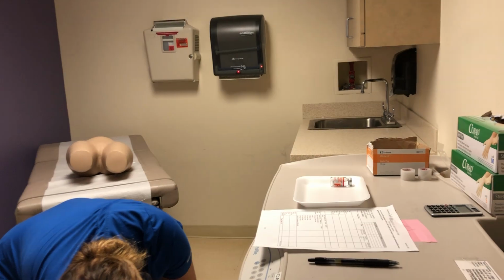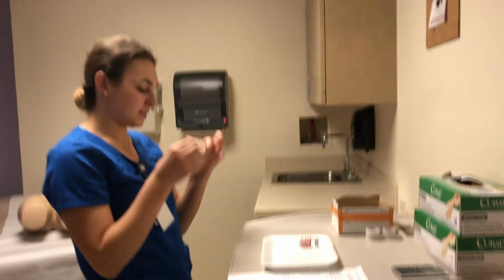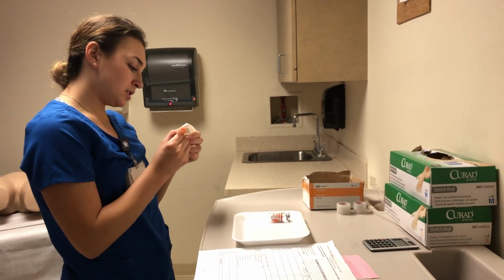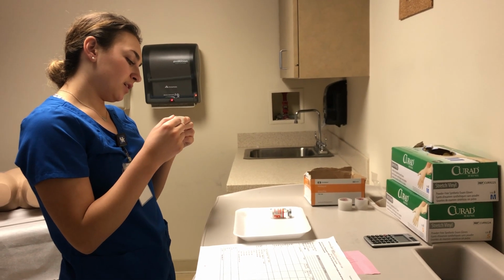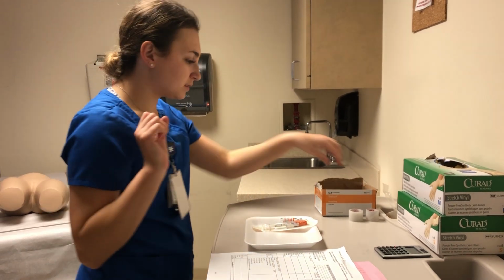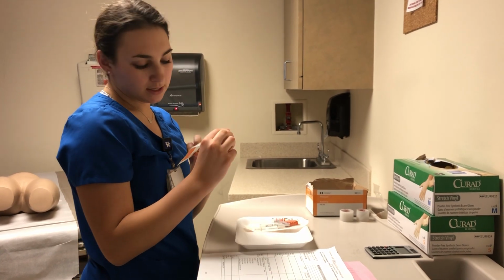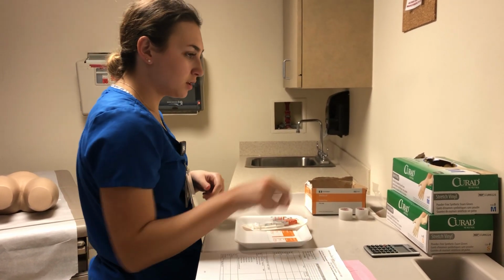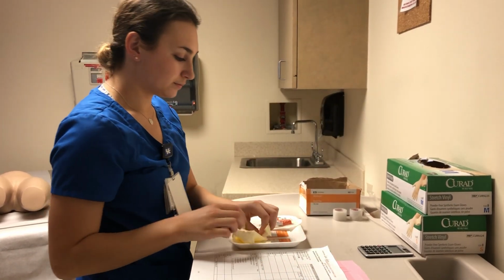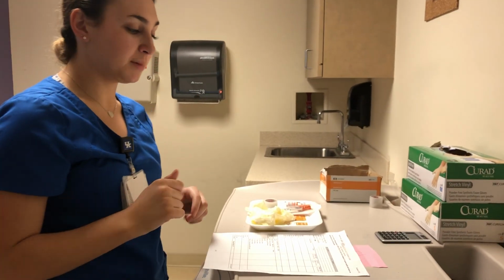I will also be getting an insulin syringe. Okay, the insulin syringe is intact, unopened, and sterile. The expiration date is November 30th of 2023, so it is also not expired, so it is safe to use. I will be getting 2 alcohol prep wipes. They are intact and not opened. I will be getting 2 clean gloves. And I have tape so that I can verify that the syringe I'm bringing my patient is the correct one for him.